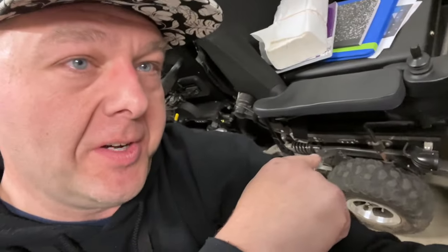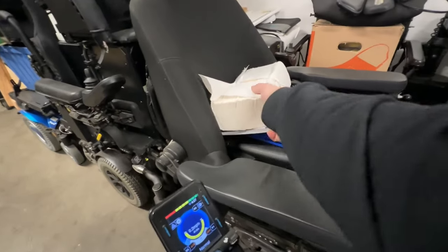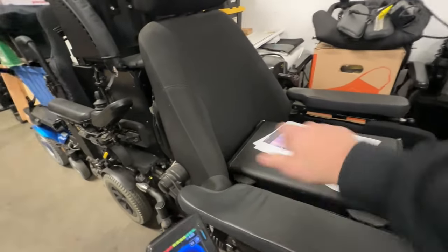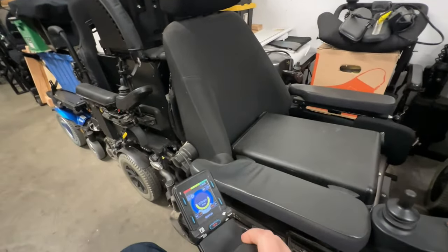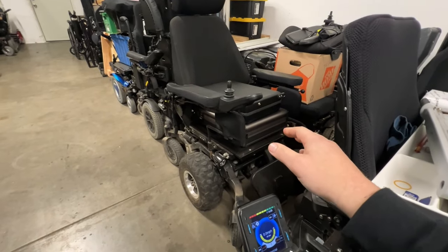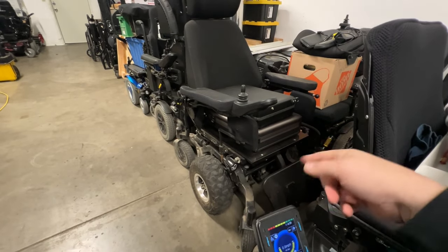Okay, impromptu thing today — we've arrived at the warehouse and the plan is to unearth the Frontier V6 and run around in it a little bit. The reason for that is we're going to be using it up on the mountain later this week. The way lead acid batteries work in mobility chairs is when they sit around for a while they tend to lose a little bit of capacity, and it takes a couple of cycles to get the capacity back up again.